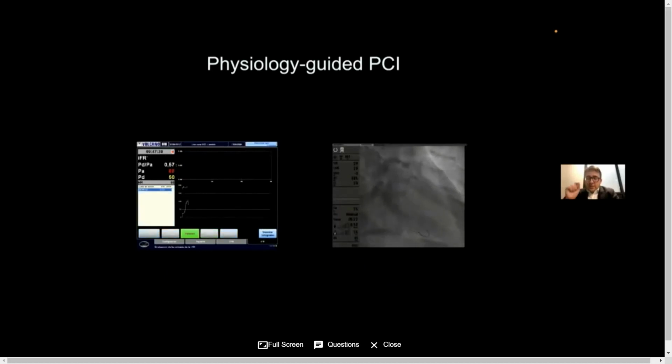Now, we saw and identified on the angiogram that lesion in the mid-vessel. So what we're going to do now is do a slow pressure wire pullback. This is how we do the co-registration. So we're screening all the time as we come back. And what we're looking to see is where this step-up was. Now, many of you will be thinking that the step-up should have occurred already, but you can see the blue line is absolutely flat. And we're pulling back further and further till eventually there's a big step-up which occurs in this artery.